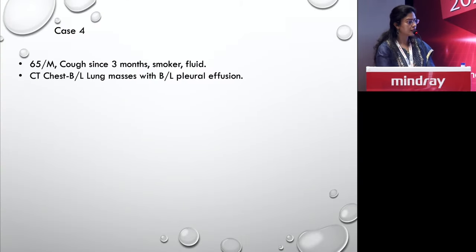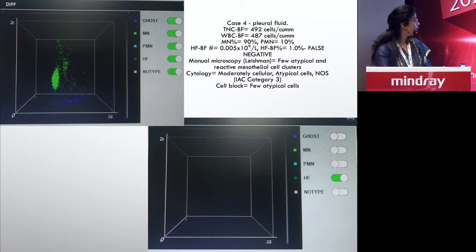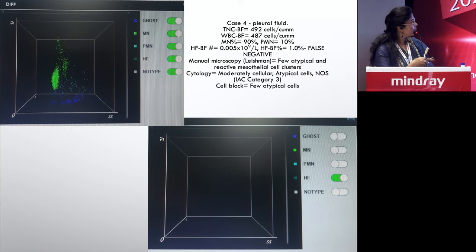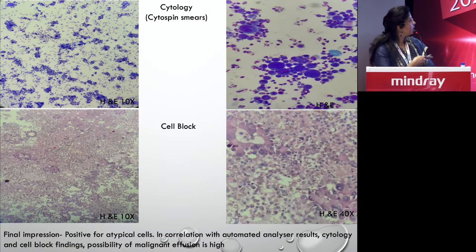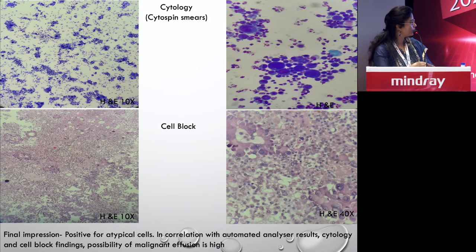Case four is a 65-year-old male, a smoker with cough, whose CT showed a lung mass with bilateral pleural effusion. The total count was 492, WBC body fluid analysis revealed 487, and in the high fluorescent area there were only around 5 cells. This was a false negative because the cell block showed few atypical cells. The cytospin smears showed some atypical cells, but the machine did not pick them up in the high fluorescent area, and cell block proved this was cancer.